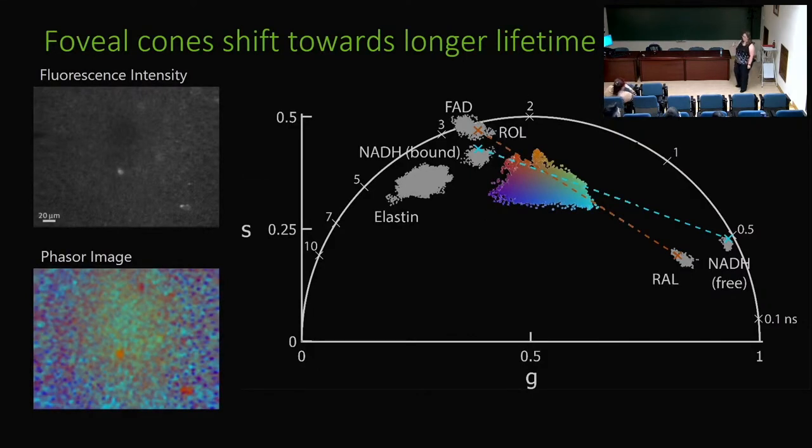The stimulation comes from our imaging laser in and of itself. It's monochromatic, a 730 nanometer stimulation. It's just the imaging beam itself. It's so bright that it leads to stimulation. And interestingly, Christina Schwartz, when she was postdocing with us, did calculations, and the ML cones are actually much more stimulated by the 730 nanometer light than the S cones are. And so it's an interesting quandary as to what's happening. Is it a two-photon vision phenomenon? What exactly is happening? And she's been looking at that, I think, in more detail as time progresses.